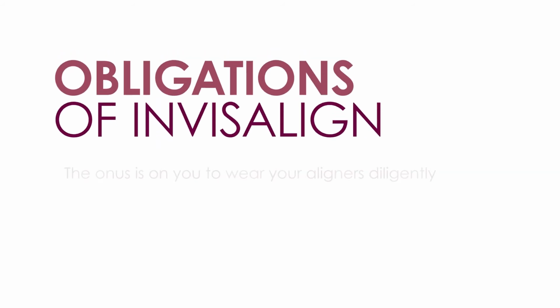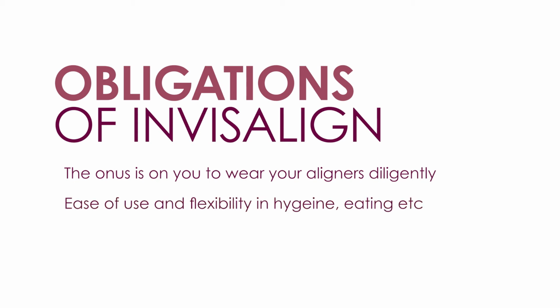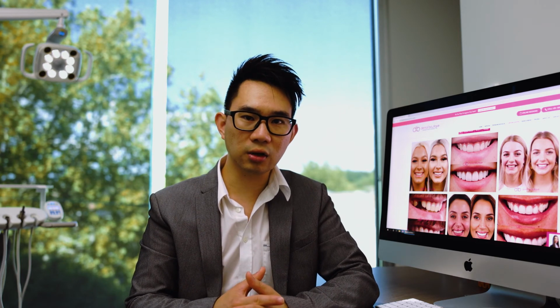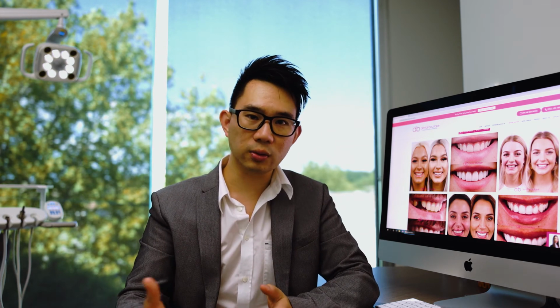While with Invisalign, the onus is on you to ensure the treatment works by putting them in. But at the same time, you get the benefit of maintaining normal hygiene, where you can just brush normally, floss normally, eat normal foods, and have the advantage of a very clear smile during the 1 to 2 years of getting your smile corrected. So again, there's no right or wrong in any situation. Make sure you discuss with your dentist or orthodontist what your needs are in your lifestyle, because a lot of this is very lifestyle connected. If you can't be compliant, braces is probably the way to go. If you can be compliant and brushing is something you don't mind, then probably Invisalign is the way to go.